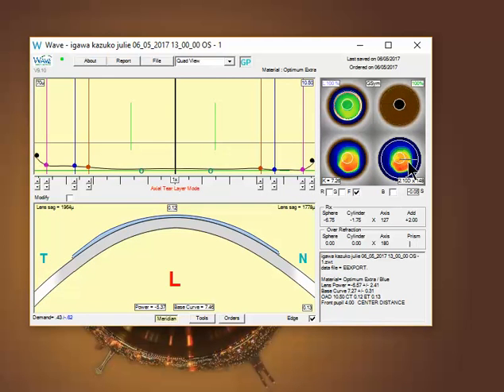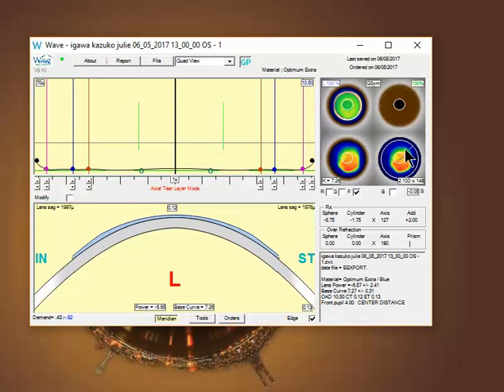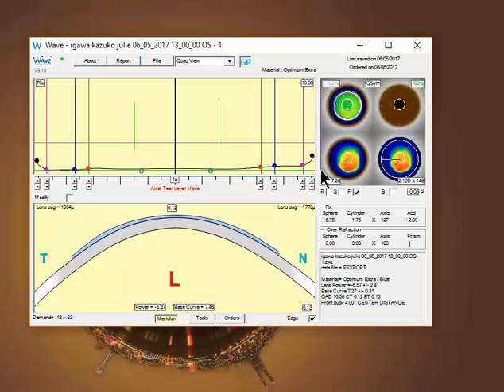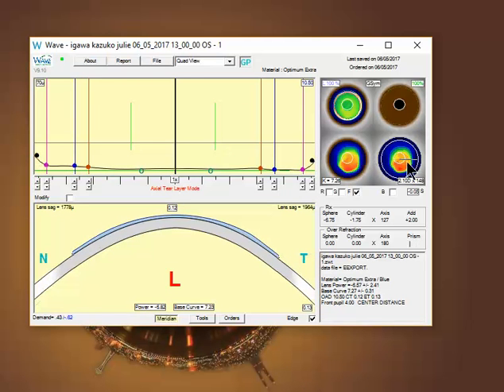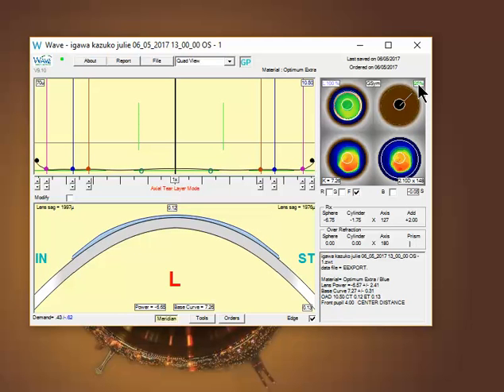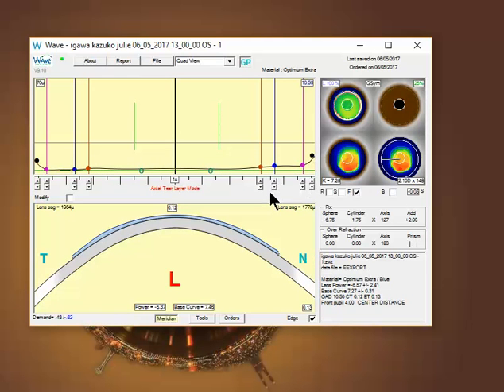You can also go through each meridian to make sure you don't have any areas that are lifting up too much. For example, at this nine o'clock meridian, you're sticking up a bit. You can always go to 25% and then bring that meridian down if you need to, just to get that aligned as well as you can.